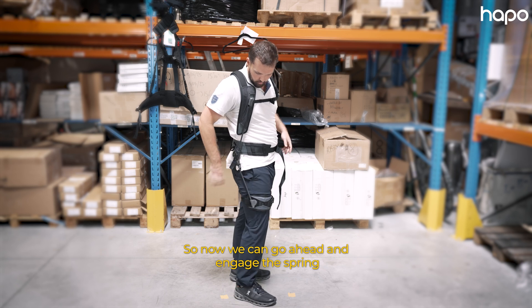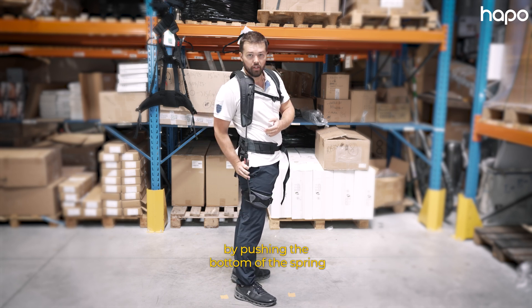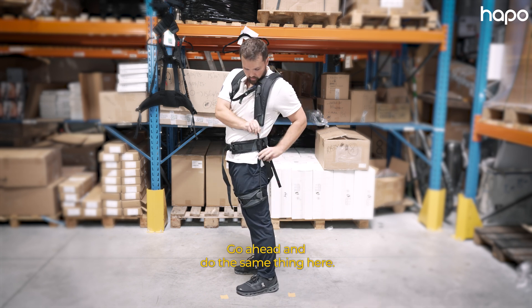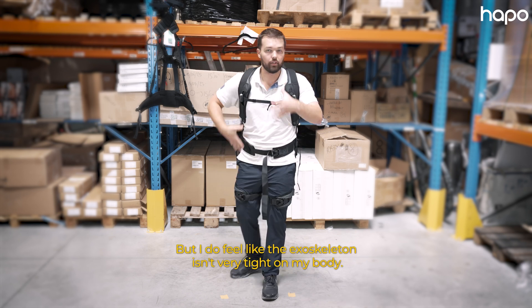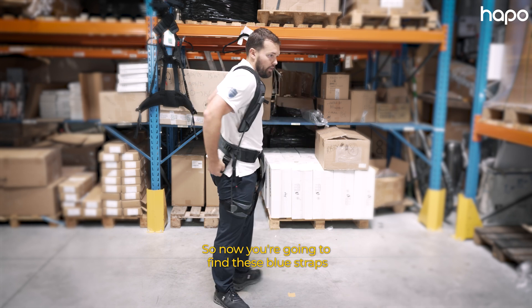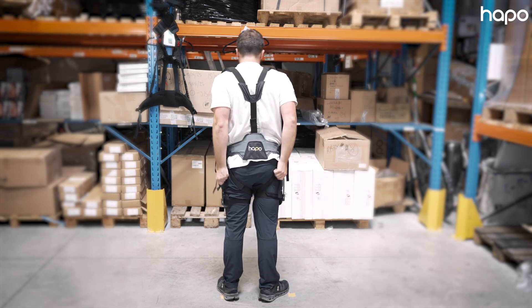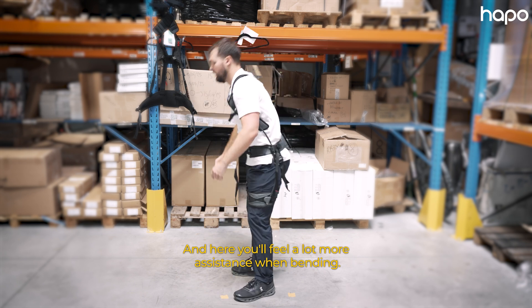Now we can go ahead and engage the spring by pushing the bottom of the spring up forward, and you can slide this disc down. Go ahead and do the same thing on the other side. Right now it's engaged, but I do feel like the exoskeleton isn't very tight on my body. So now you're going to find those blue straps that were loosened in the beginning and really go ahead and pull down and tighten them — you'll feel a lot more assistance when bending.